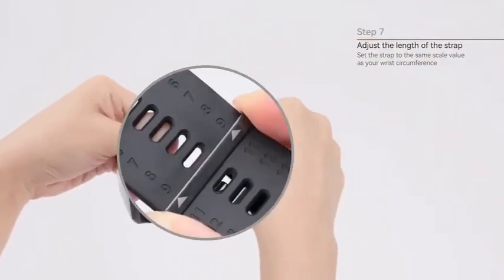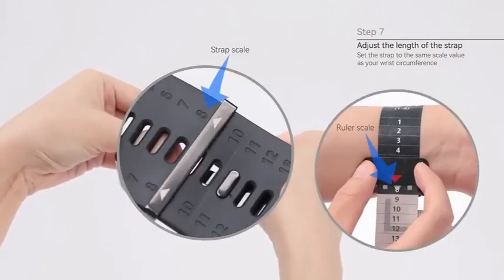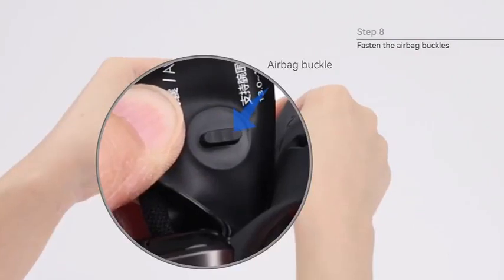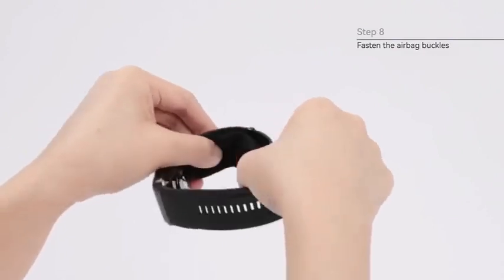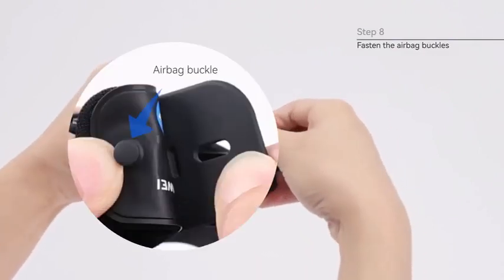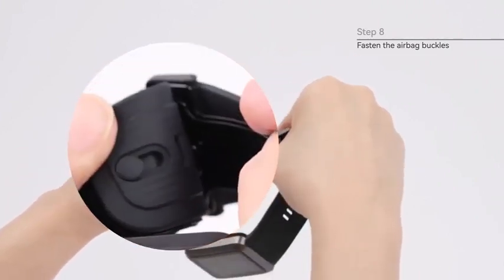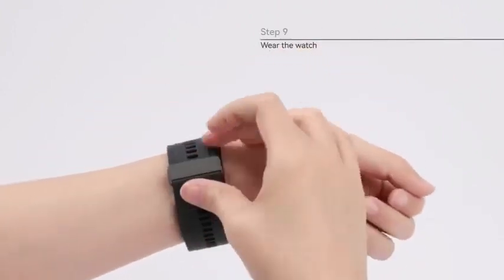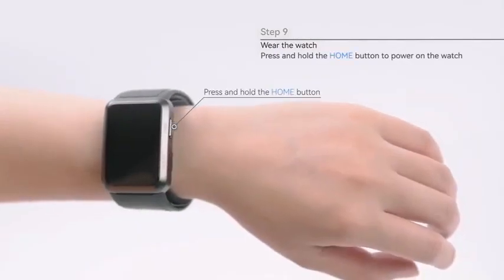Step 7: Adjust the length of the strap and set it to the same scale value as your wrist circumference. Step 8: Fasten the buckles at both ends of the airbag. Step 9: Wear your watch. Press and hold the home button to power it on.